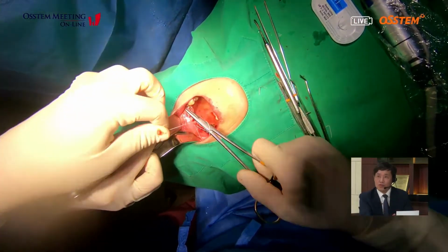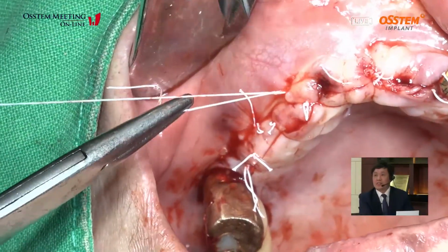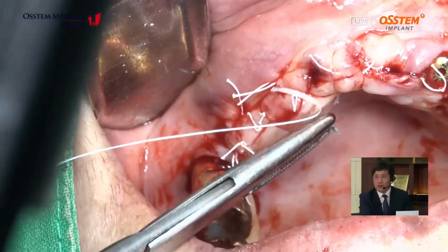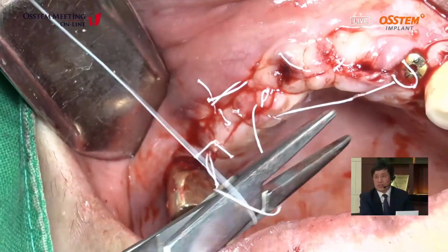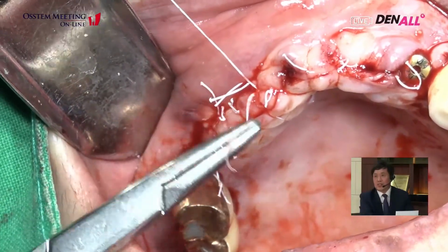Yeah, Dr. Kim, what kind of suture material do you use? Yeah, this is a PTFE suture material. As you know, PTFE is the material of Gore-Tex, and usually the Gore-Tex is expanded PTFE.